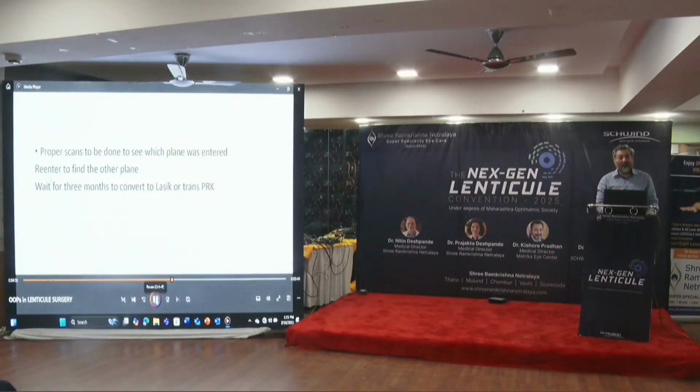So which other plane have you dissected? Another SMILE patient, another SMILE surgeon, in another clinic. I struggled for 40 minutes, and then I took the patient to his friend, and it took him not even 30 seconds to take the lenticule out. And he thought he was such a bad surgeon. The whole question is, when you start panicking, you don't see anything.